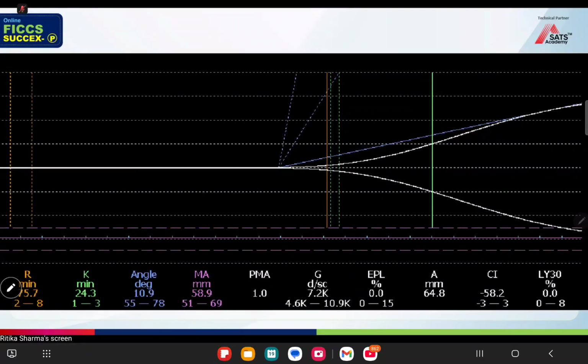Read this. This is a thromboelastogram. This is the diagram of a thromboelastogram. The R time looks increased in this. What is the normal R time supposed to be? Just tell me the abnormalities. Increased R time.